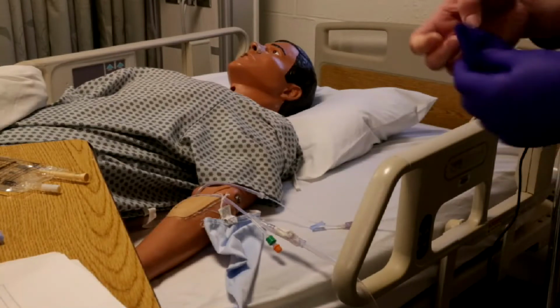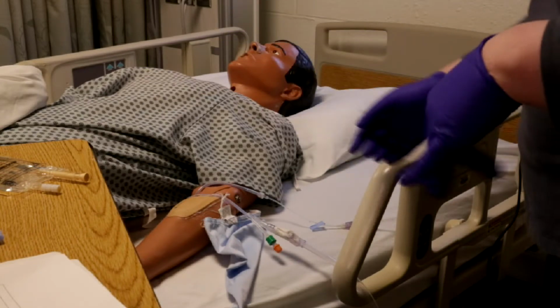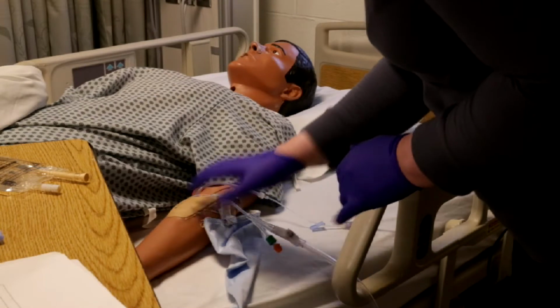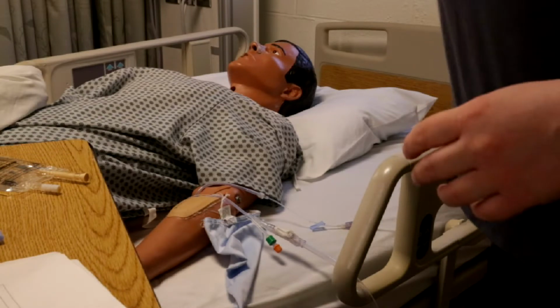Okay, so now I'm going to get some gloves on so that I can inspect the site. I already have some sodium chloride running through this line, but I just want to make sure that it still looks good and it's clean, dry, and intact. So now I'm going to take my gloves off and throw them away. Do some hand hygiene.